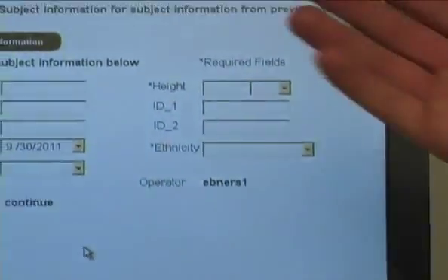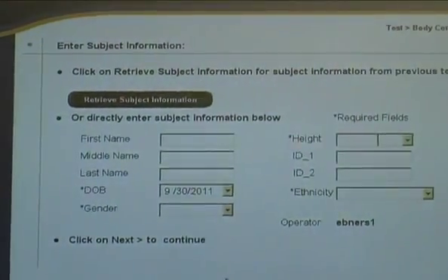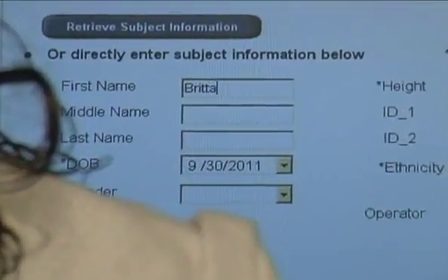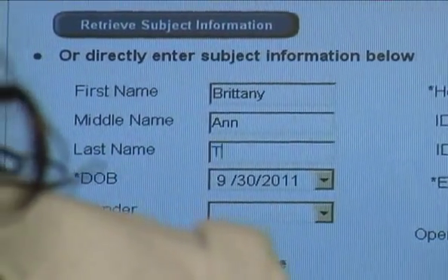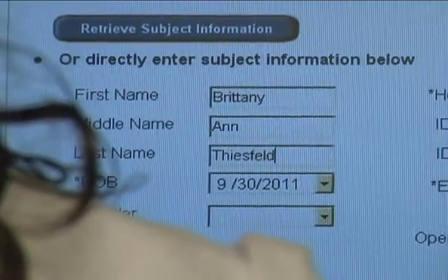Okay, so here's where we enter the demographic information. If you could enter Brittany's information. Any field that has an asterisk is required. The other stuff isn't required. Thanks again for doing this, Brittany. Okay, sure. And then he's spelled THIESFELD.